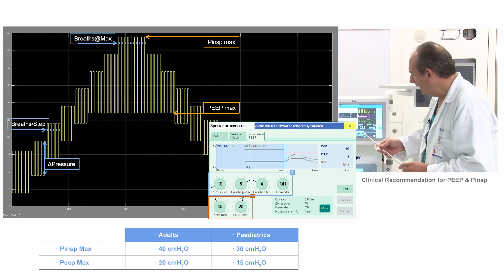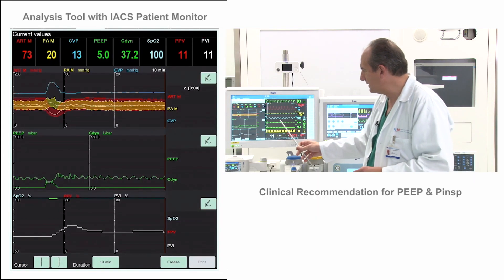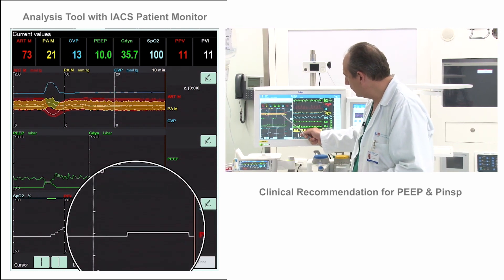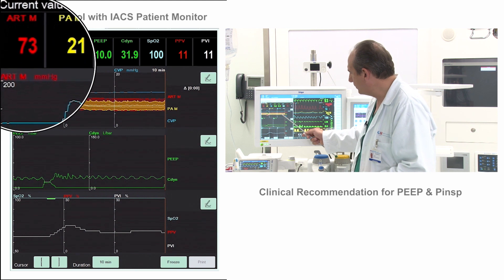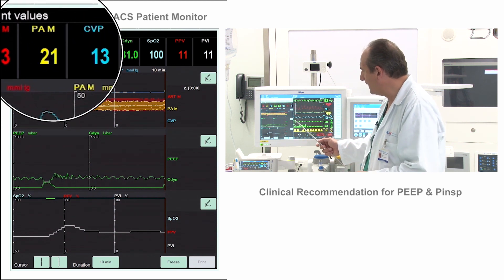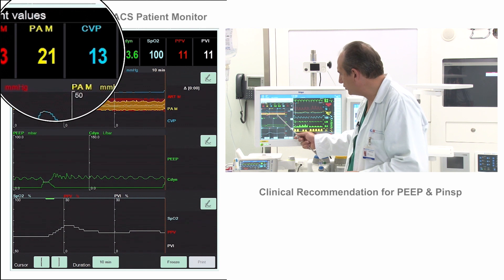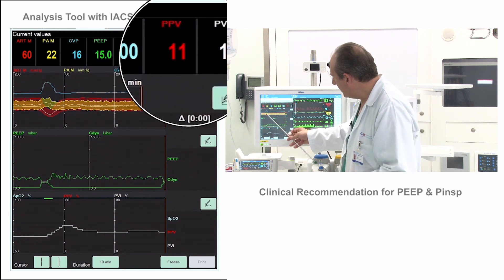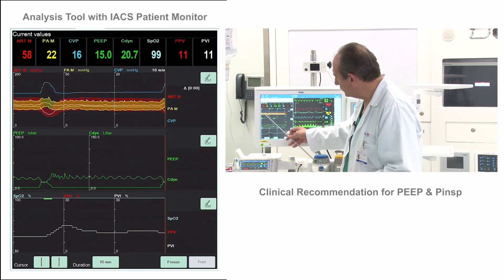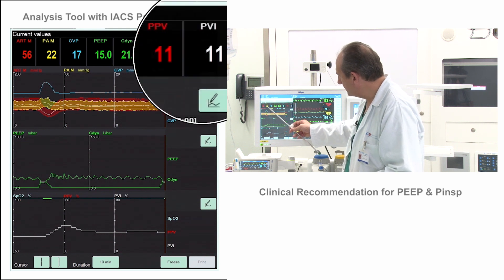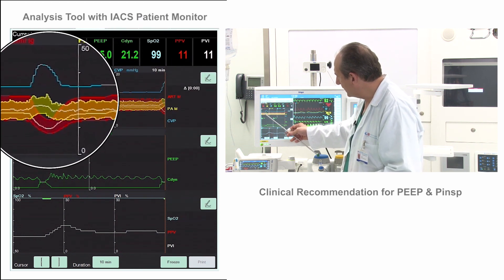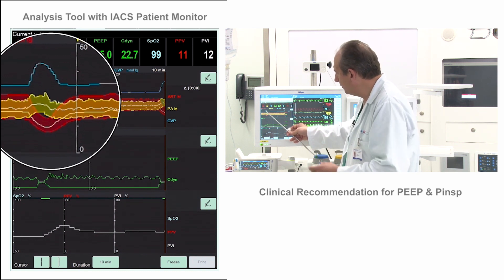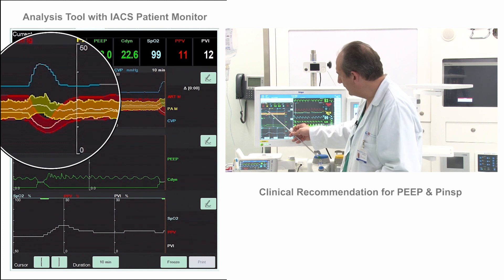So we push start. The great thing is that we are going to see at the same time the real consequences on all sides. Here in red we have the mean blood pressure, in yellow is the pulmonary mean pressure, and here we have the PIP, dynamic compliance and PVI. We did the manoeuvre five minutes before, and you can see all the effects. The blue line is central venous pressure.